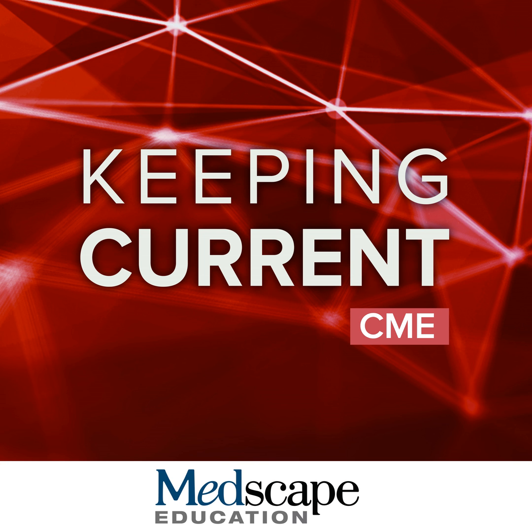Now, there are many indications for cardiac MRI. In this talk, we're going to primarily focus on ischemic heart disease, but all the other indications are listed here, and it really covers the full spectrum of cardiovascular disease. So this is not really so much a niche test anymore. It's really much more of a mainstream test for assessing cardiac disease. So let's delve into some of the techniques for late gadolinium enhancement.